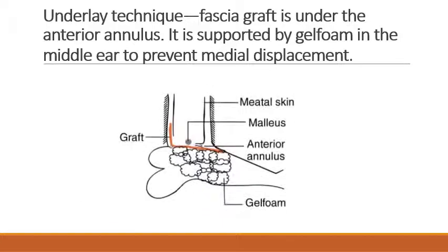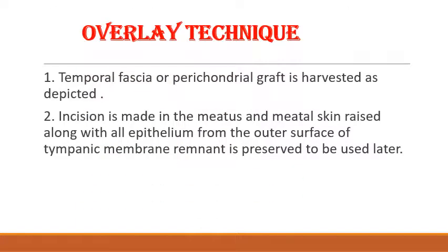This is the picture depicting the underlay technique. The fascia graft is under the anterior annulus. It is supported by gel foam in the middle ear to prevent medial displacement. Next is the overlay technique.